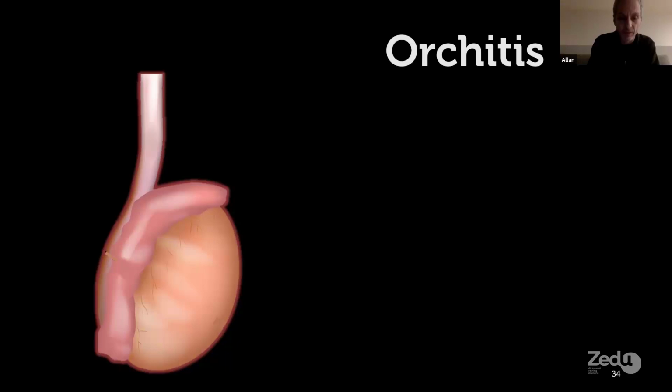I try to use power Doppler, but obviously you've got to try and get rid of all movement. If your hand's not perfectly steady or the patient's moving a bit, then power Doppler becomes a bit more challenging. But I try to use it. And you raise a really good point here, because especially with novice users, when you're just learning to do scrotal ultrasound, the hardest thing to do is to keep your hand still.